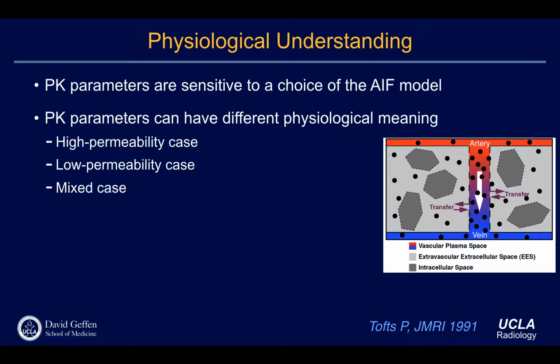The fact that you know it goes fast from A to B, does it really mean it's perfusion? It depends. In a different tissue status, the permeability and perfusion act together. If it's a really highly permeable situation, meaning everything is going really fast, then the transfer constant is only governed by flow or perfusion. In a tumor, it's very leaky, everything is leaky. So when you measure K-trans in the tumor, that's perfusion. But in a normal situation, it's going to be a mix of permeability and perfusion.